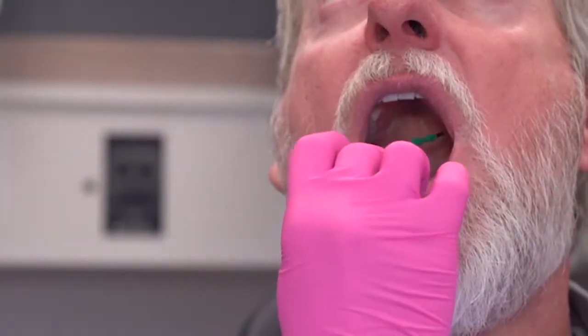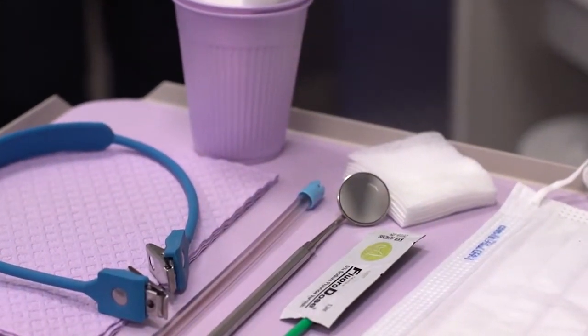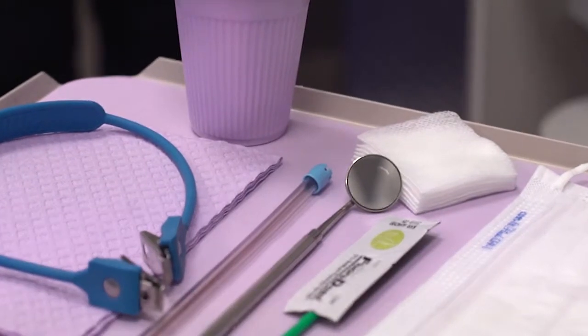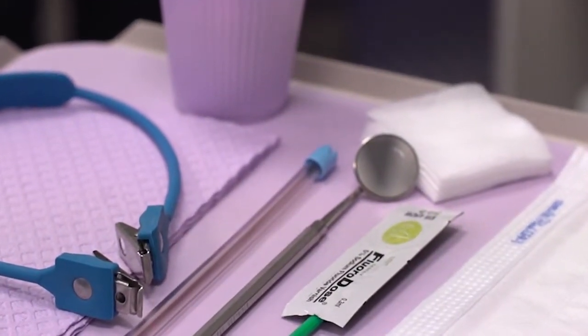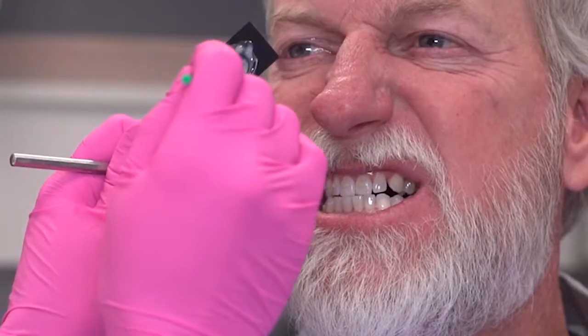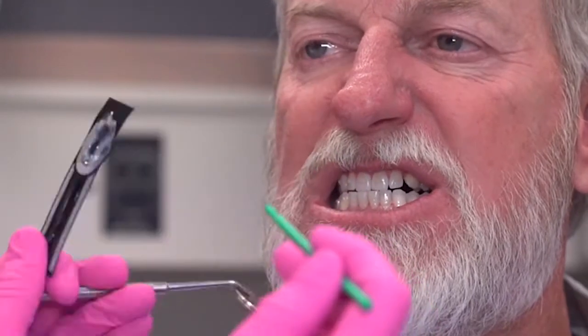It's important that you don't get too worked up about painting each individual tooth. Fluoridose has capillary action, and the fluoride is going to chase into any areas where there's moisture. So it's going to go in proximally without you painting it in proximally. Just give it a nice swipe across all of the surfaces, and the capillary action will carry it into all the little areas you don't cover.